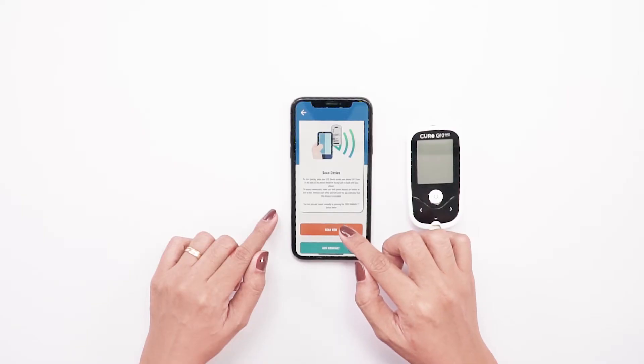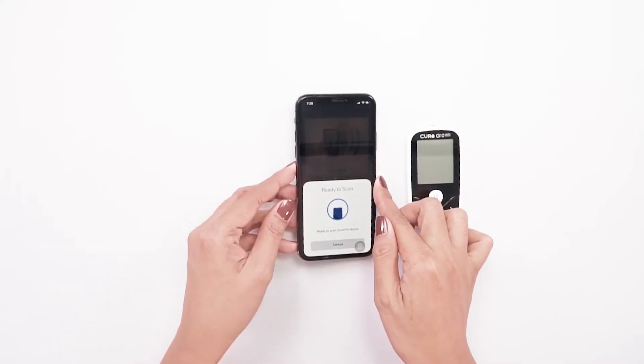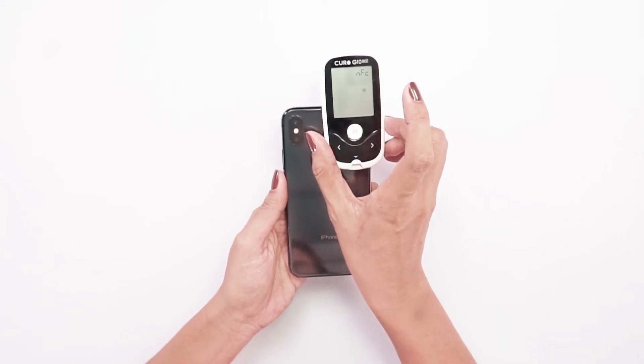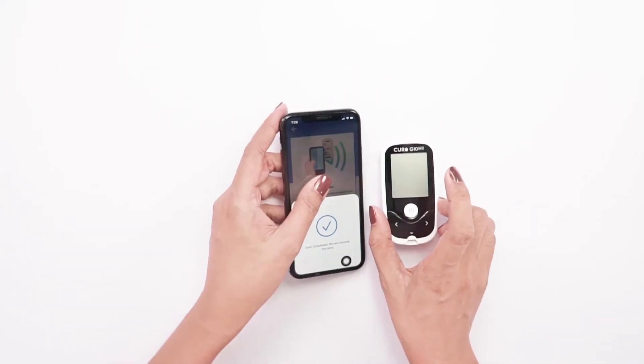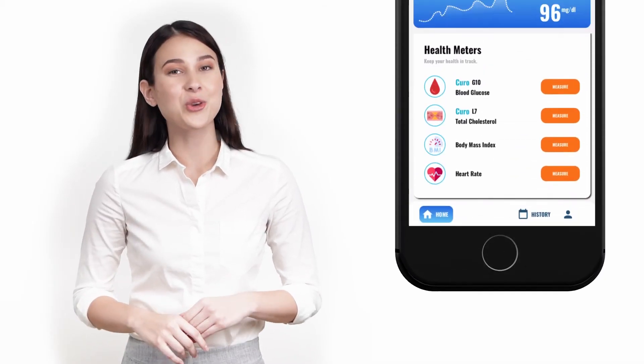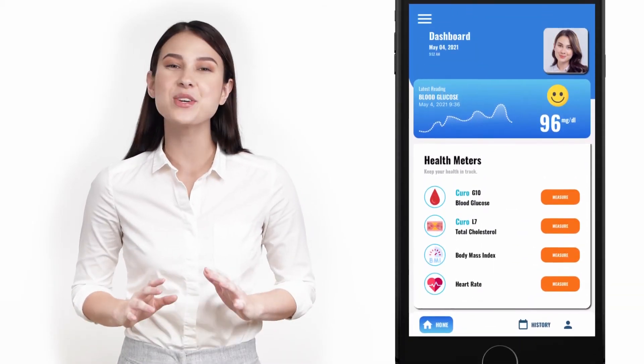Place your Curo G10 device beside your phone to ensure connectivity. Make sure both paired devices are within an inch or less of each other. The Curo mobile app also has an easy-to-navigate interface.